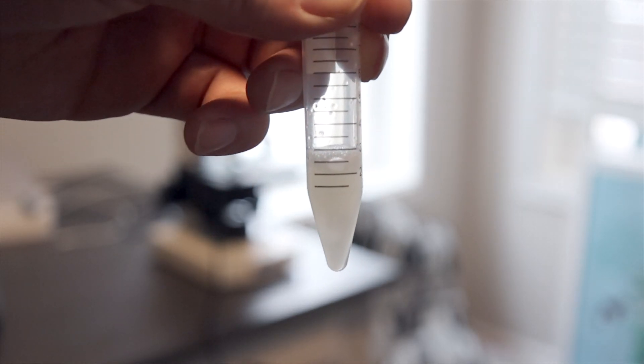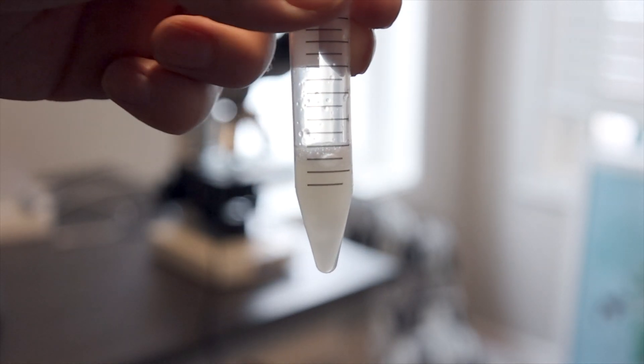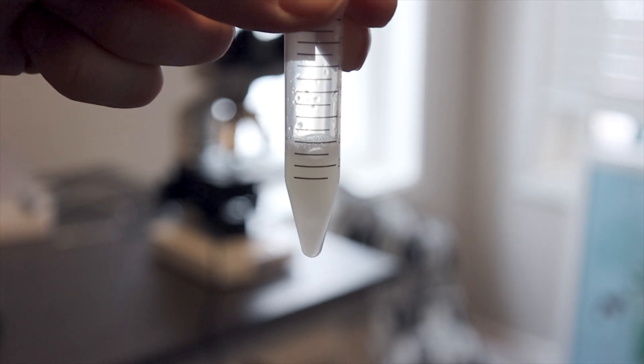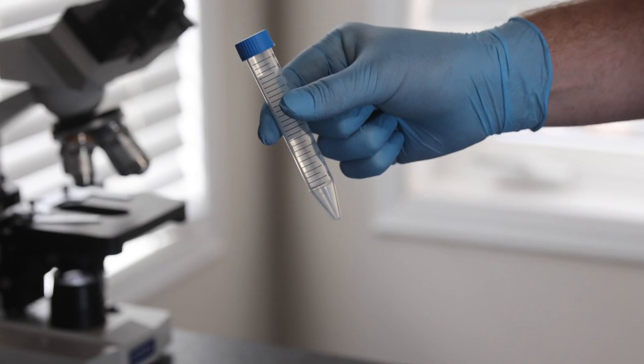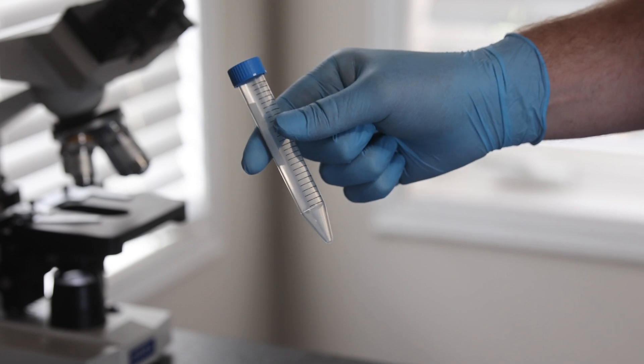You're going to need to have your collection funneled into a sterile centrifuge tube. Since the sample sizes can only be a few milliliters, make sure you have a tube that's concave at the bottom which allows for maximum extraction using the insemination rod during the later stages.